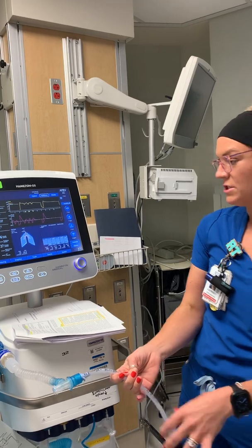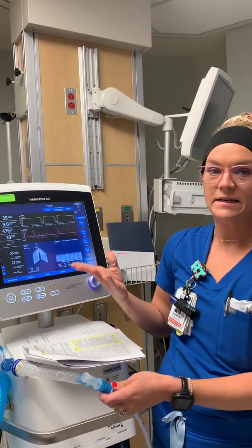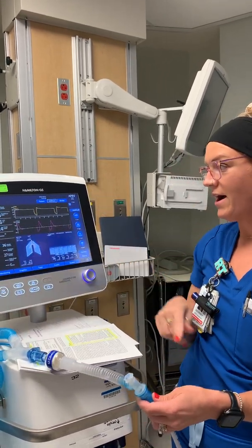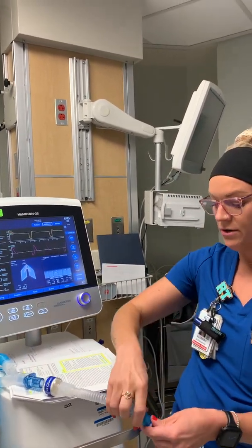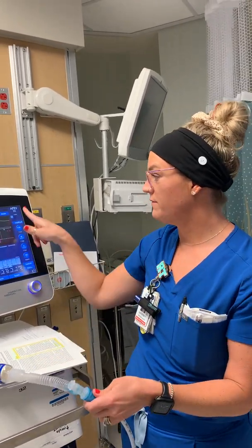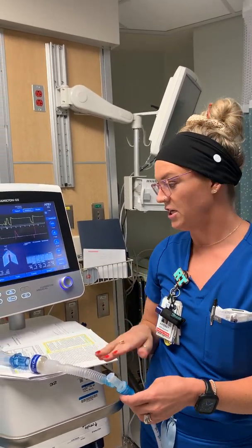If you switch to this mode and hemodynamics tank — blood pressure goes down, PIPs go way high — the best thing you can do is release that pressure, switch back to the previous mode, and reconnect to the patient. The patient simply did not tolerate that change.